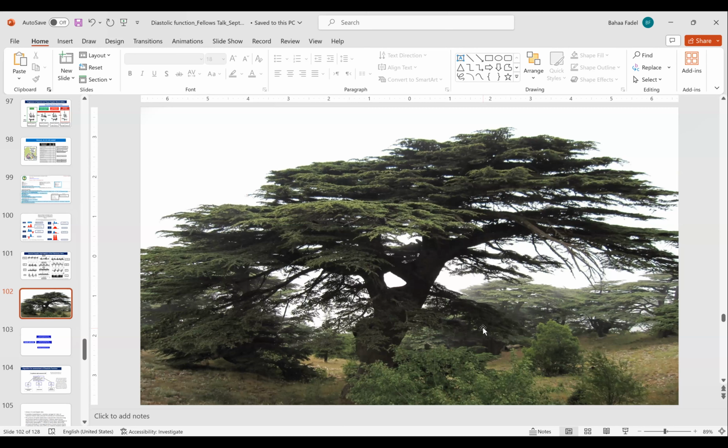Now the guidelines tell us to average both the septal and the lateral. Obviously, it's important to look at the E over E prime, but it is one of several parameters. I suggest you look at everything else. You really need to know the patient's age, as I mentioned, and the patient's history. You need to look at all other parameters. The guidelines tell us to look at the E over E prime ratio, the TR velocity, and the LA volume index.